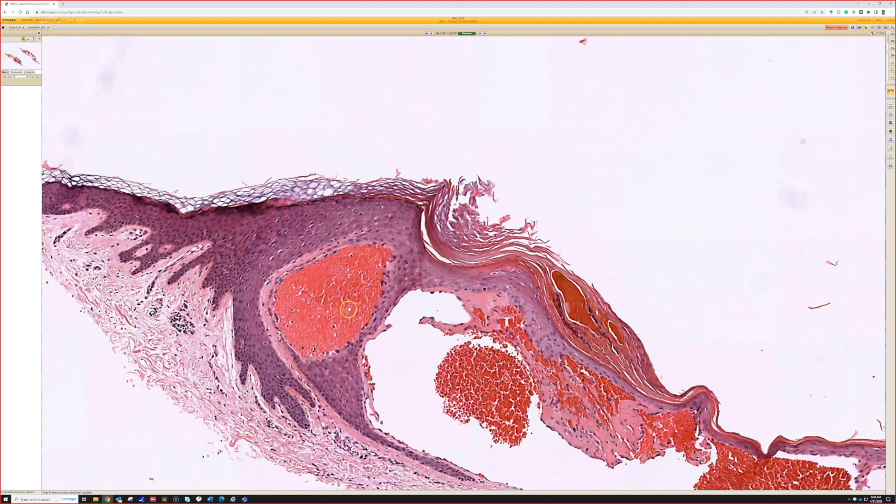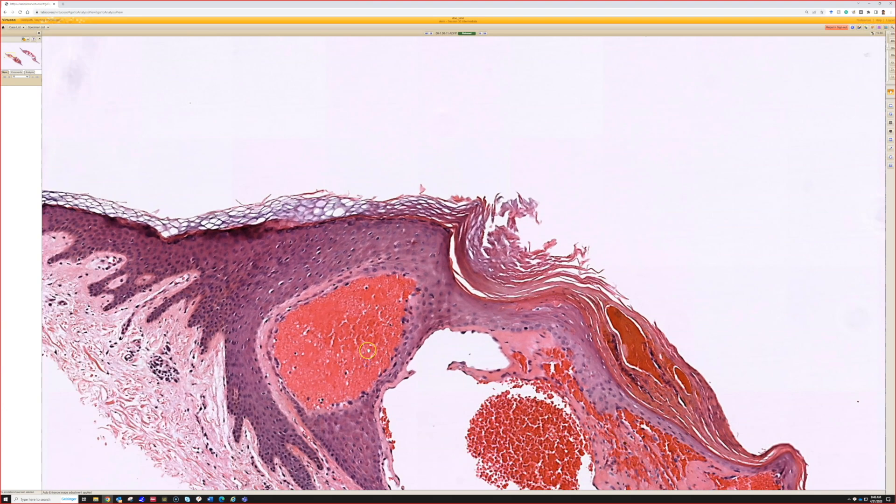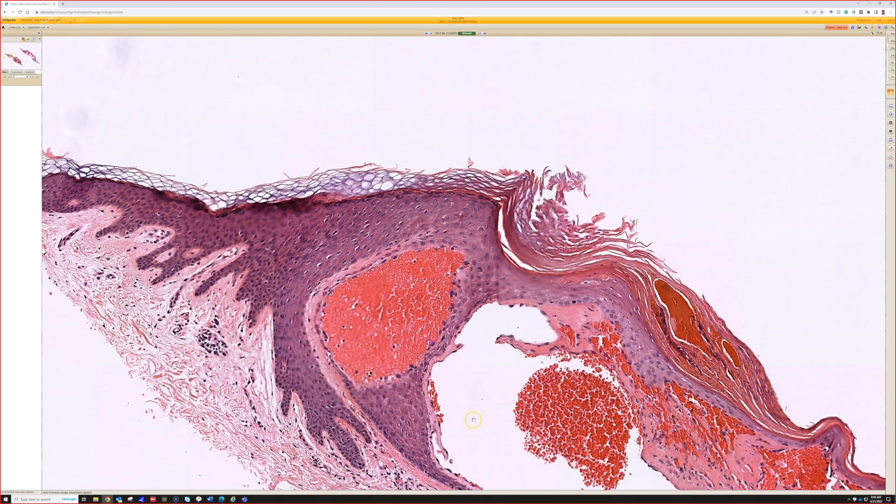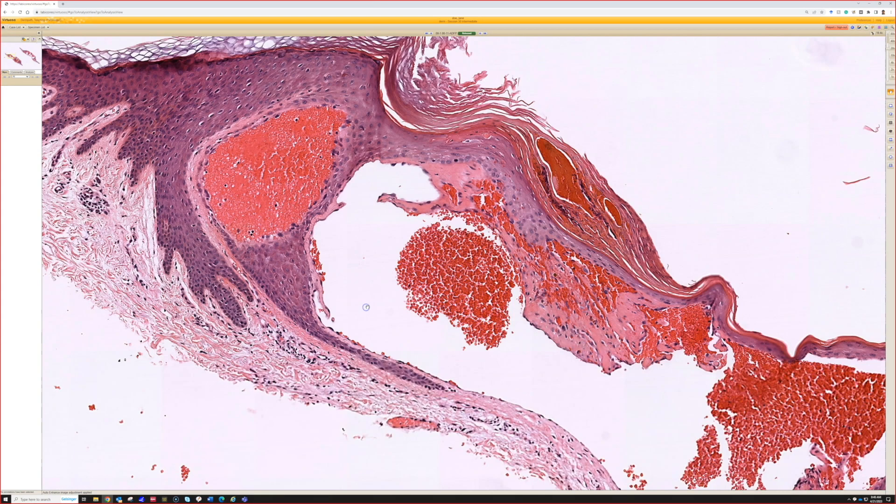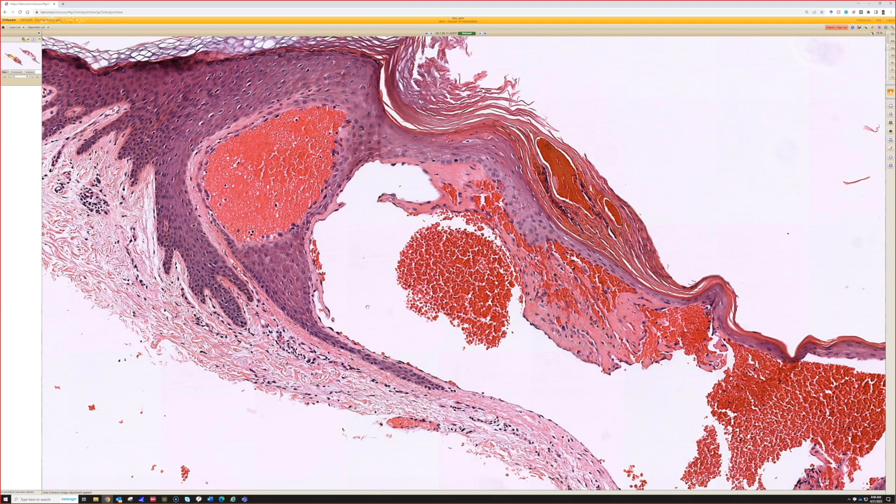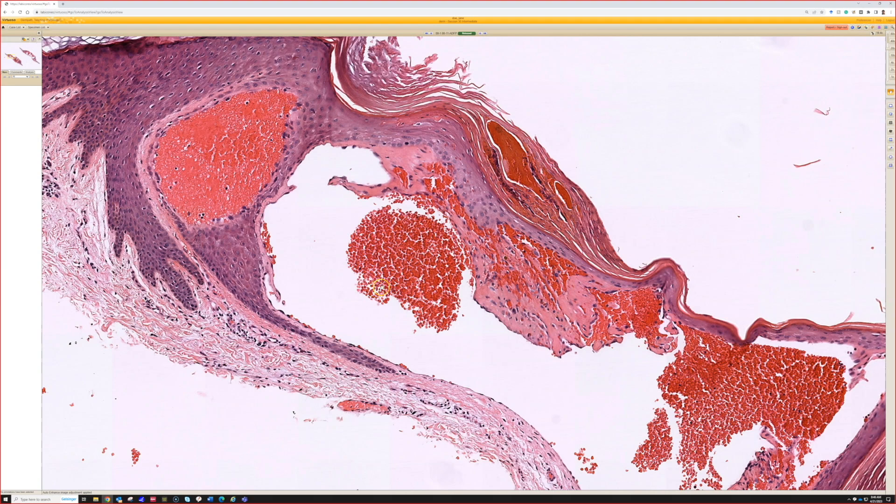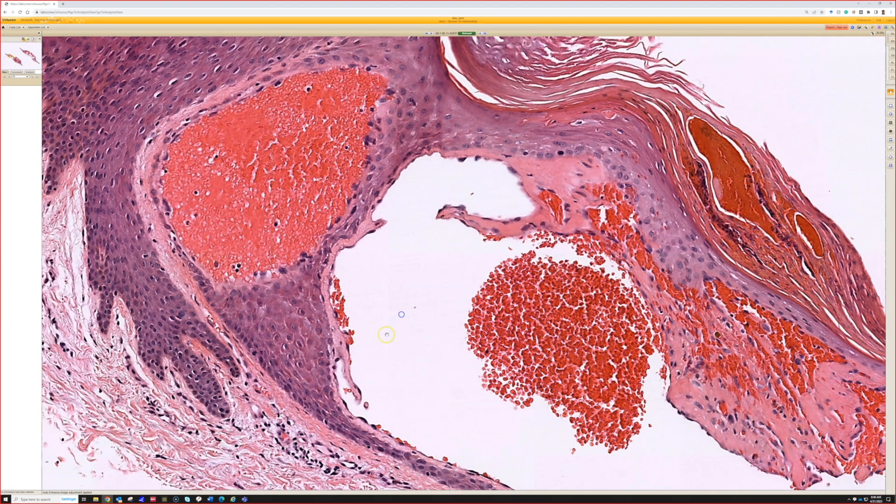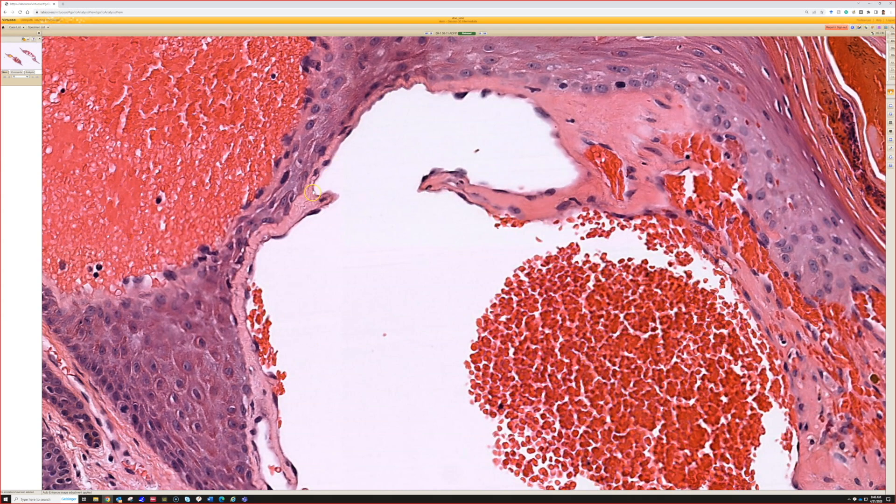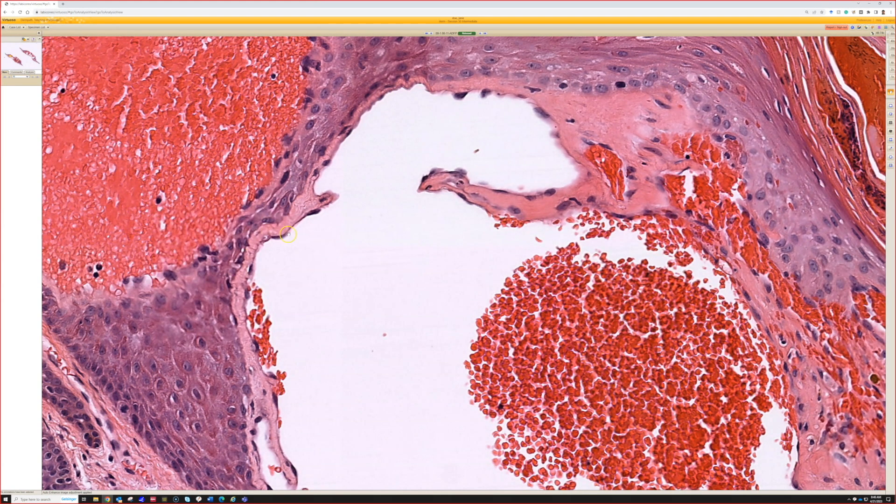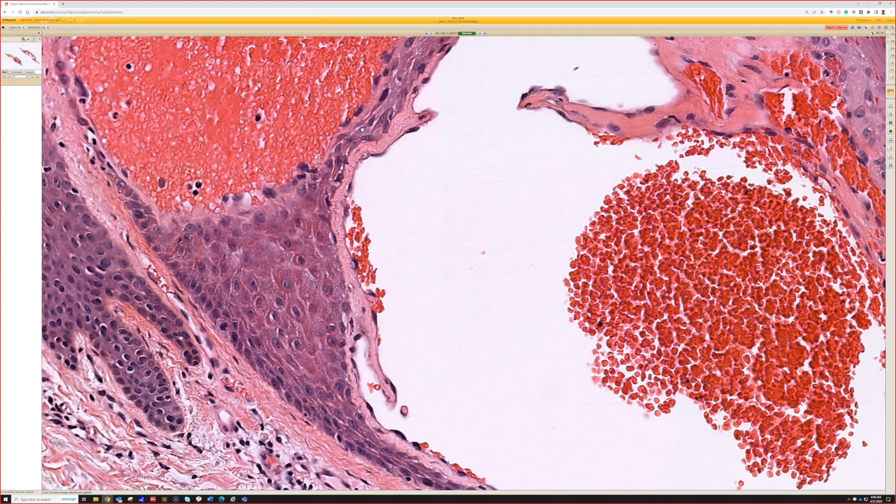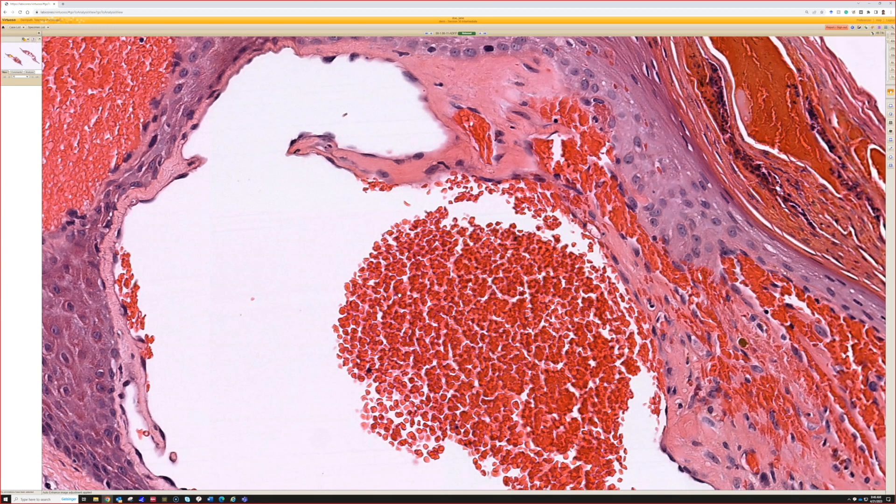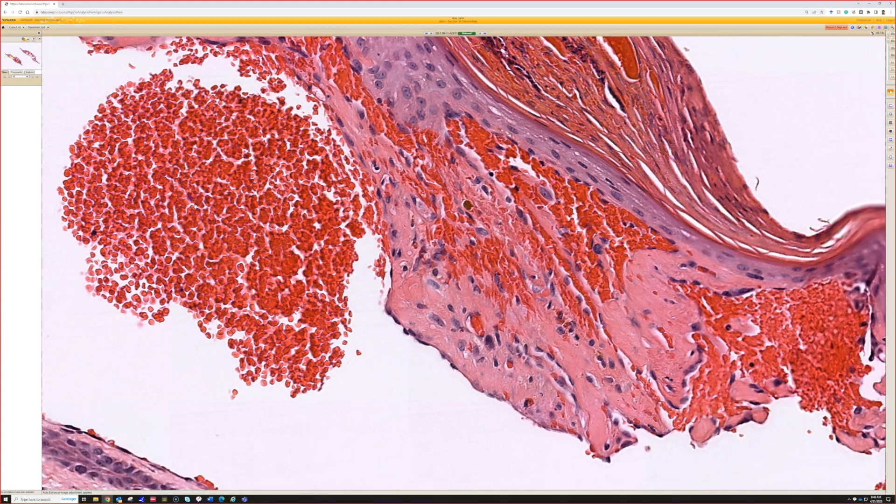The epidermis reaches down and wraps around each channel, which makes it look like, this case doesn't show perfect complete wrapping of each vessel, but it doesn't have to be perfect wrapping of the vessel. But you get what looks like a vessel floating in the middle of the epidermis. It's kind of an illusion because look, you can still see there's a little layer of collagen right here between the endothelial cell and the epidermal keratinocytes because vessels can't just exist totally naked in the epidermis. They have to have a connection to the dermis and they're going to be surrounded by basement membranes.